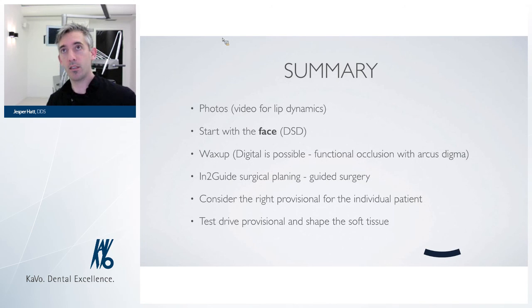And it gives us an idea of something we're looking for functionally. We haven't been able to see that in our practice, but when the patient gets home, the patient does whatever the patient does with her or his jaw movements. They function like they do usually, and they break something. It tells us something. Then we can correct it in the provisional, test it again, and as soon as the patient doesn't break anything, we know we have the option to do something that will last a really, really long time.